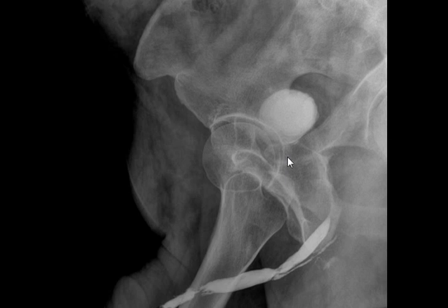You put it where? In the fossa navicularis, which is the end of the urethra. There is a dilatation. Okay, you put the balloon in the beginning of the urethra and you inflate it. Usually I use not more than 2 to 3 cc of air, and it's very painful.